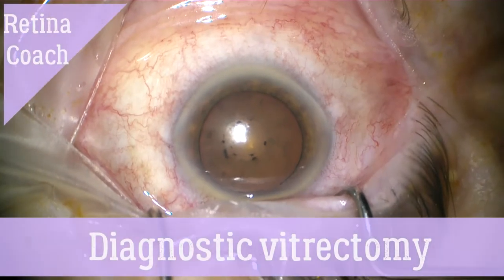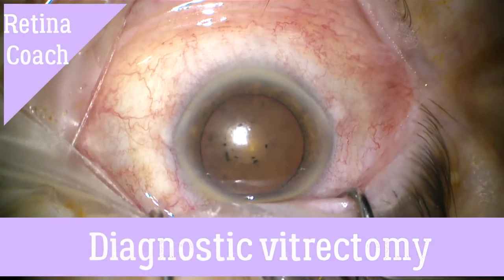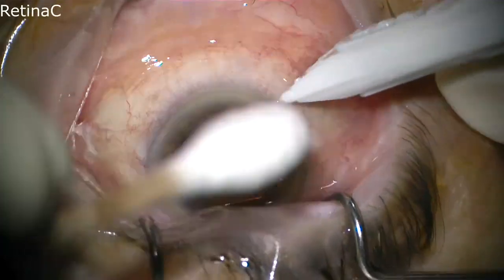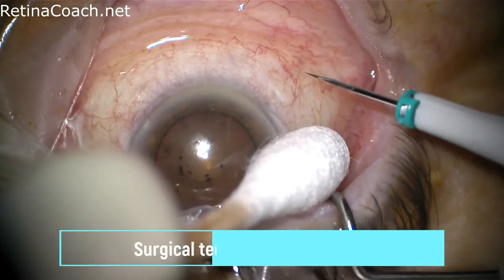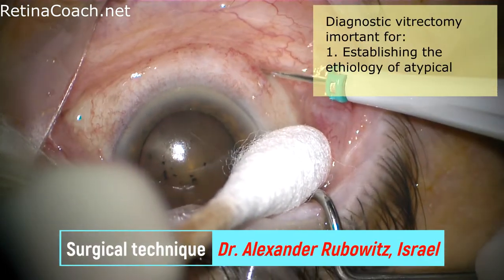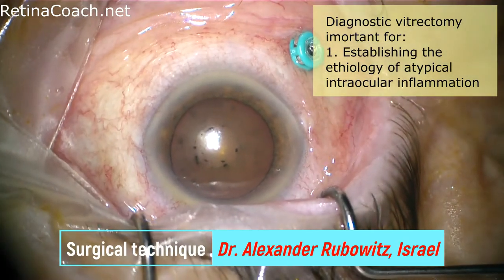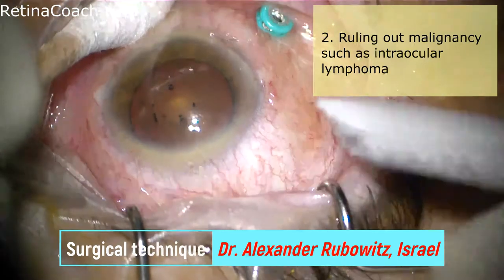This is Anfisa from RetinaCoach and today I will talk about diagnostic vitrectomy or vitreous biopsy. Vitreous biopsy is an important and useful method for establishing the etiology of atypical intraocular inflammation and ruling out malignancy such as intraocular lymphoma.